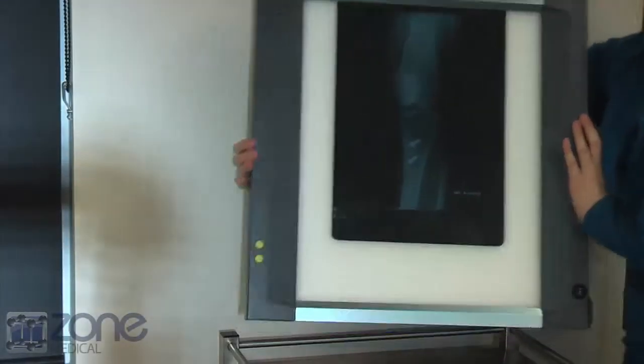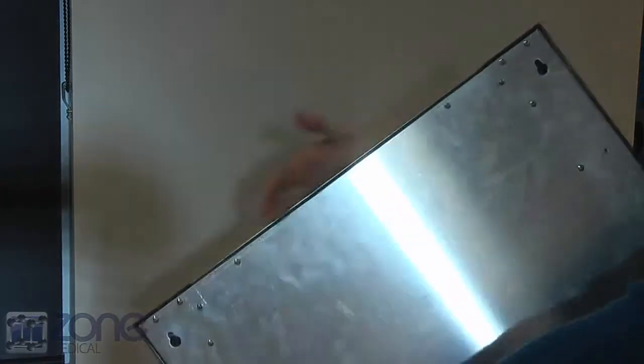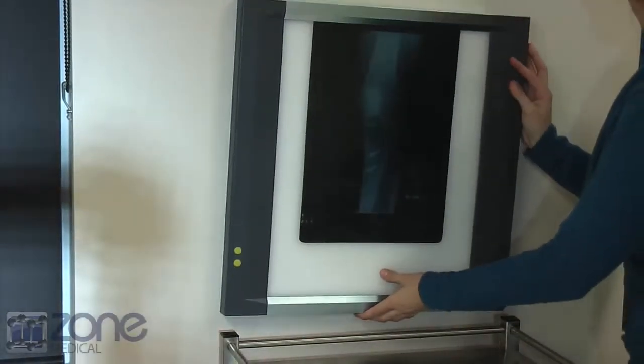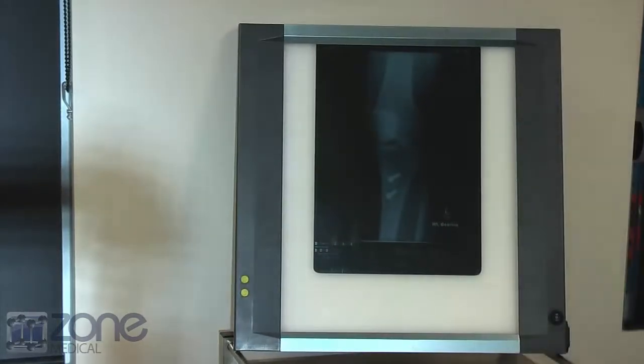There is an easy setup. Firstly, you will need to mount the X-ray viewer to the wall. You can do this by using the two spaces at the back of the viewer and hanging it up with screws, just like a picture frame. Make sure that the viewer is above or near a power point.